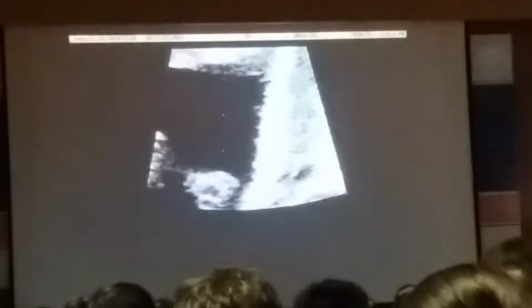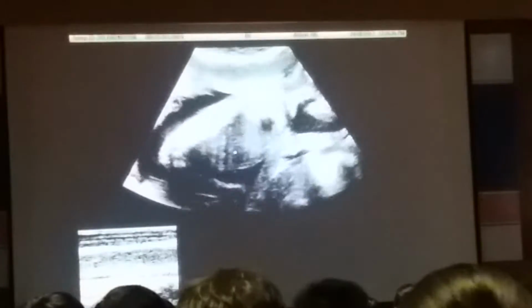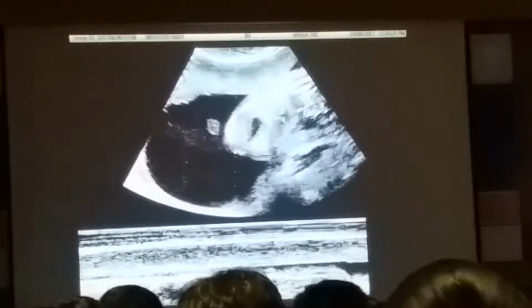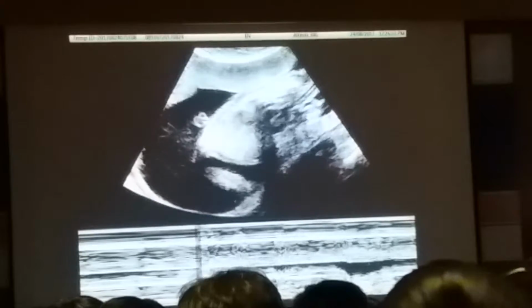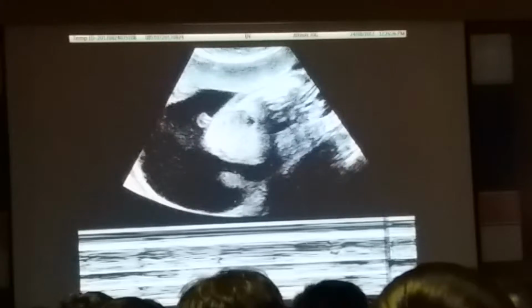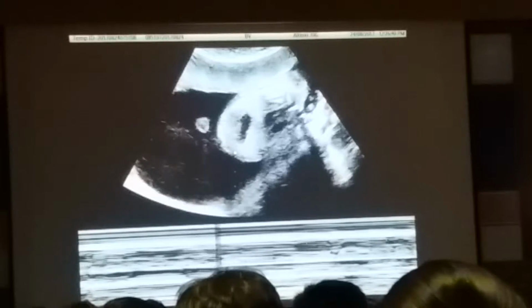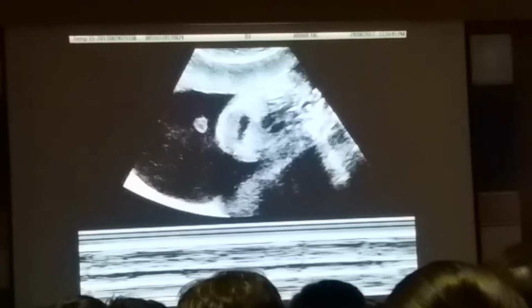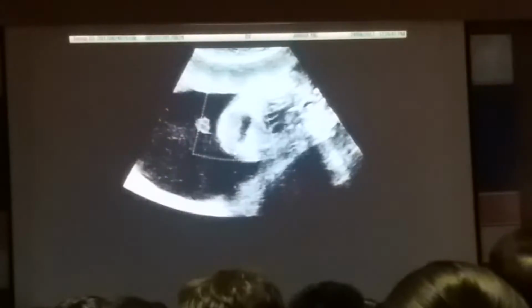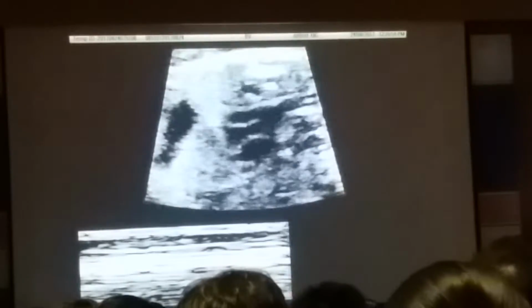Okay, where are we now? Then we want to come off soon. Okay, let's see where we are now. Okay. There's ascending aorta and arch. Now I've got it. Okay, there's the mitral valve. Okay, now we're going to zoom again. Zoom, thank you. Okay, we're going to do that there. Zoom. Okay, there's the mitral valve, yeah.